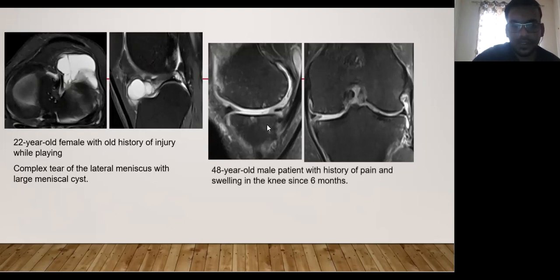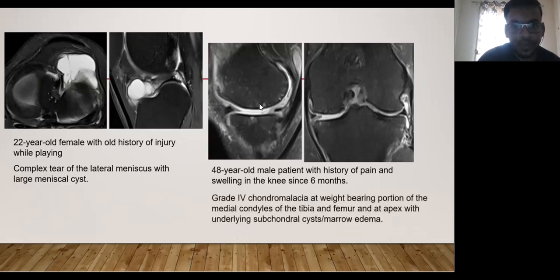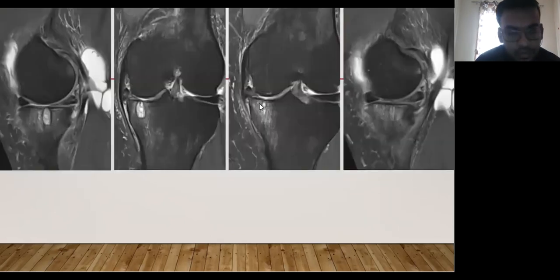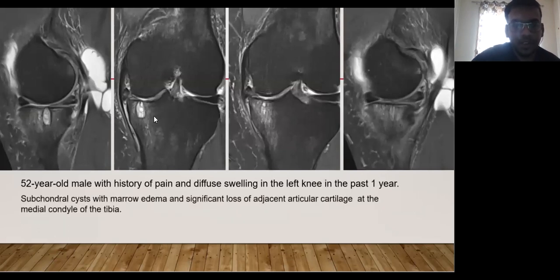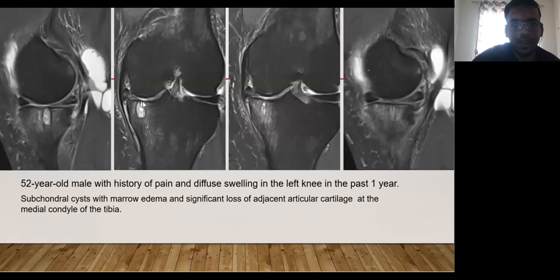A 48-year-old male patient presented with pain and swelling in the knees for 6 months. The medial meniscus is involved, and there is significant loss of cartilage along with small subchondral cysts and marrow edema, consistent with chondromalacia affecting the weight-bearing portion of the medial condyles of the tibia and femur. Similarly, a 52-year-old male patient with pain and diffuse knee swelling for one year showed subchondral cysts, marrow edema, and significant adjacent cartilage loss. There is slight extrusion of the medial meniscus with marked degeneration and injury, with subchondral changes and marrow edema at the medial condyle of the tibia.